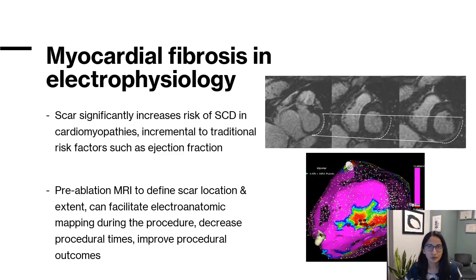This is an example of a 43-year-old male with ventricular tachycardia. Short axis MRI LGE images show scar in the lateral wall of the left ventricle, and this is predominantly epicardial in location. Image from electrophysiology study confirms the location of epicardial scar. VT ablation was performed and the red circles depict ablated lesions. Ablation successfully eliminated ventricular tachycardia in this patient.